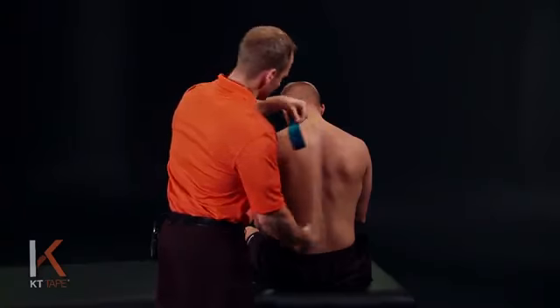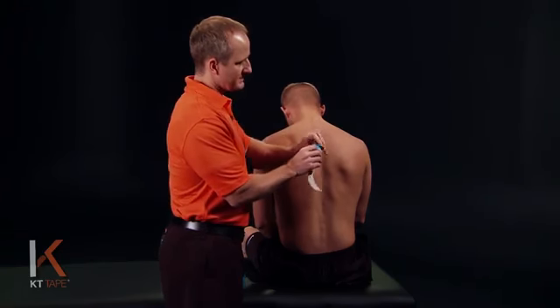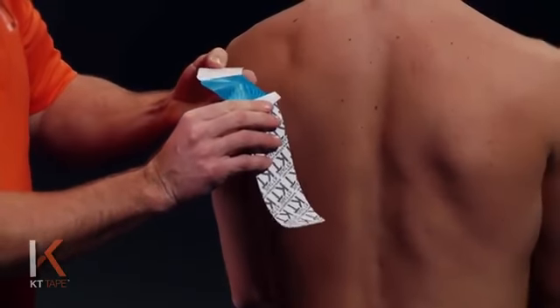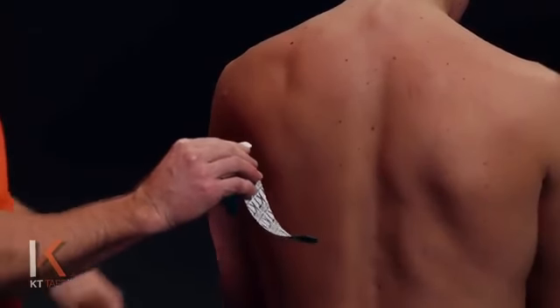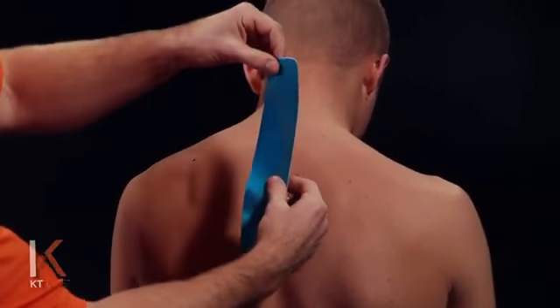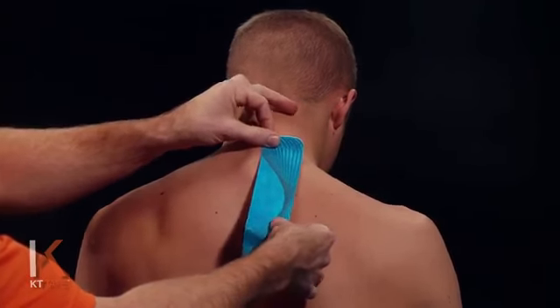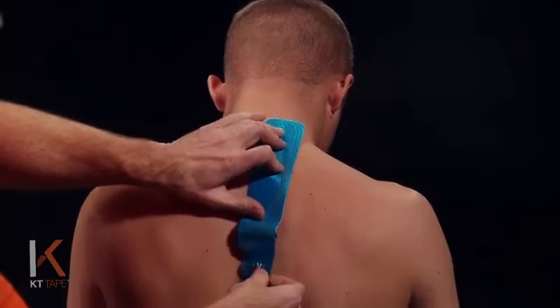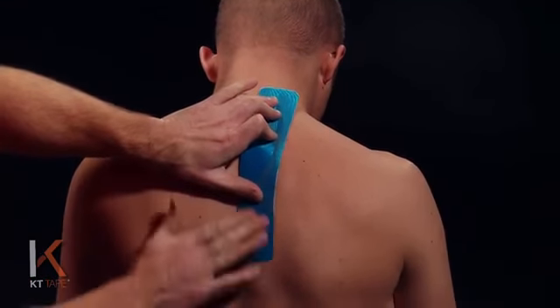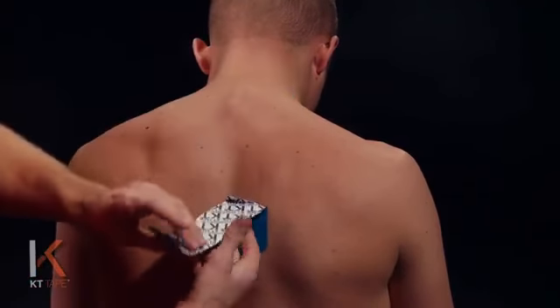We're going to tear our first strip. I'm going to twist and tear the backing paper down near one end of the tape to create an anchor point. I'm being very careful not to touch the adhesive of the tape. Okay, to measure where this goes, I'm going to go a good 3 or 4 inches below the hairline of the neck and go ahead and just let this fall. And again, being careful not to touch the adhesive, I'm applying this anchor. I'm going right over the muscles to the side of the spine.